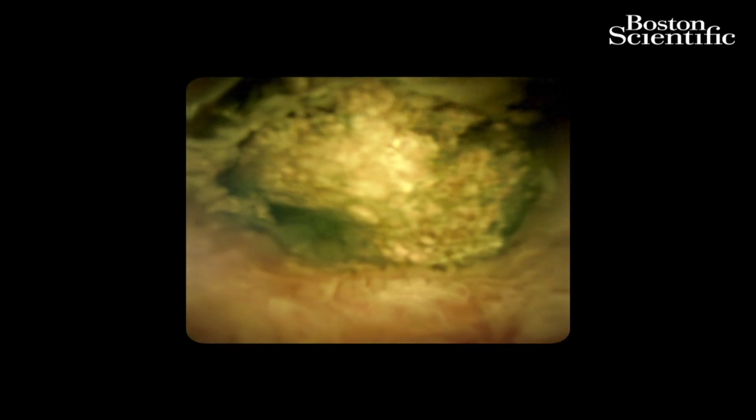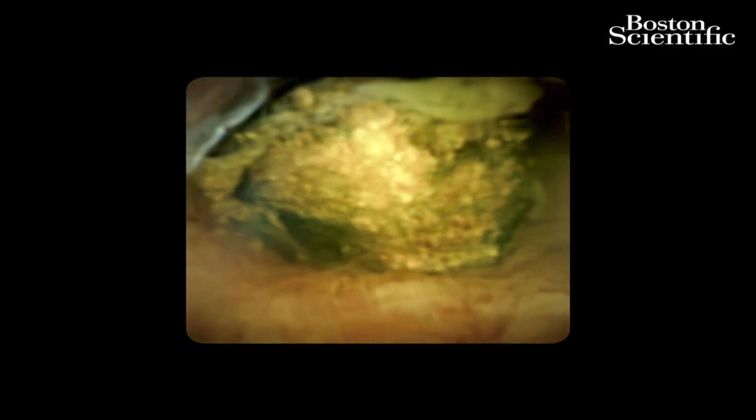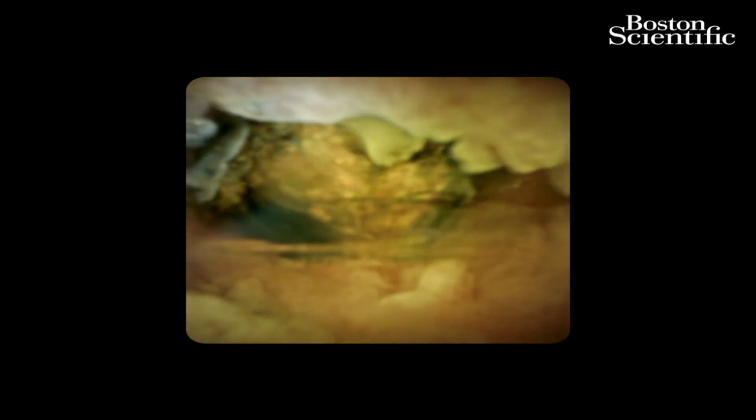What's the advantage of laser lithotripsy over EHL or mechanical lithotripsy? Yeah, I think I have little experience with the EHL, but I think the laser is probably more durable during the procedure. It doesn't usually get malfunctioned or broken. And I think the fragmentation power is much stronger with the laser lithotripsy. I heard from my colleagues that sometimes they can open 2 or 3 EHL probes in a single session. But with the laser lithotripsy, I've never opened 2 probes.